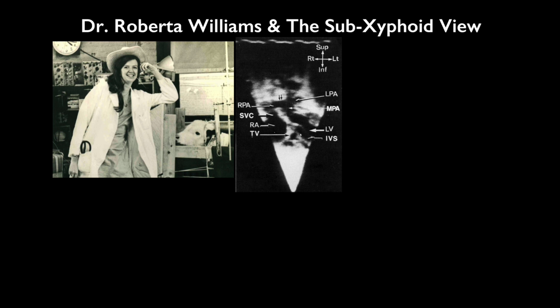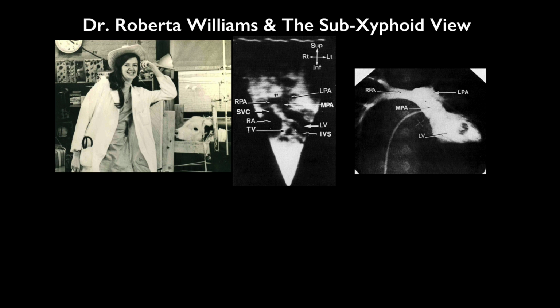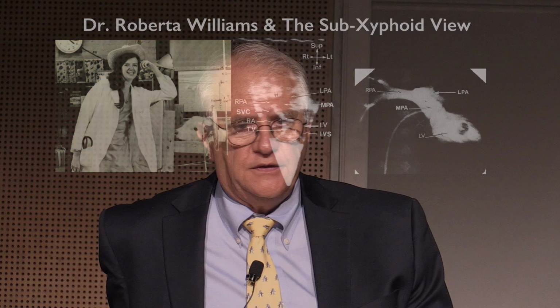And of course, one has to scan a whole image to make this view. So Roberta did a number of things that were interesting and also serendipitous, because the probes that we used were what they call a mechanical or toothbrush wobbler. And this wobbler was very difficult to use. So here is what essentially we were looking at, and of course that had to be placed in as well so that people could really understand that they were looking at a cardiac image.